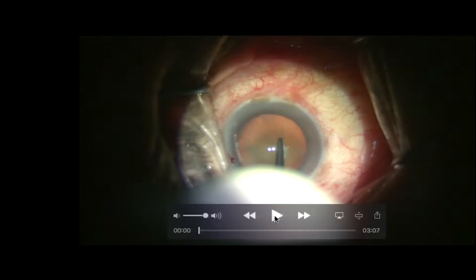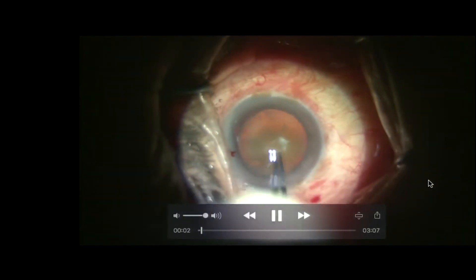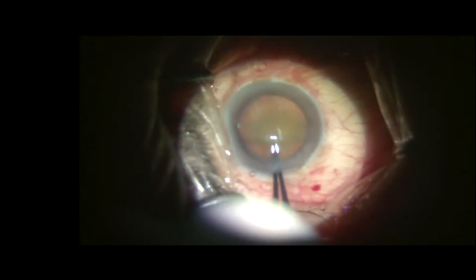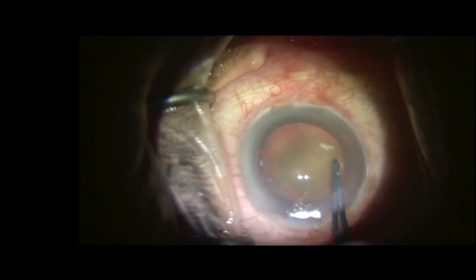I am going to show you something which has never been shown before. This is a case of absorbed nucleus with zonular dehiscence. What I am going to do is perform the normal capsulorhexis after taking the help of the cystotome.